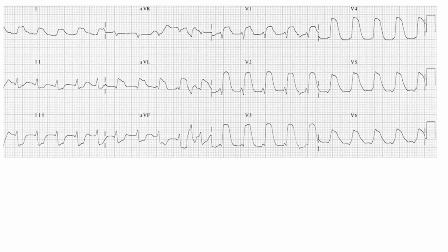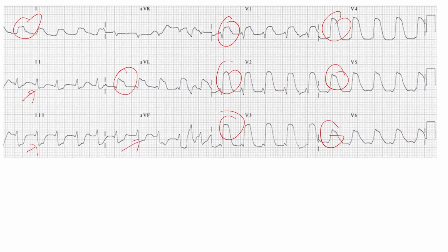Next, this is a clear-cut acute myocardial infarction. Which leads are involved? V1, V2, V3, V4, V5, V6, lead 1, lead AVL. So everything is involved: extensive anterior wall or anterolateral wall MI. You can see the reciprocal ST depression in lead 2, lead 3 and AVF.